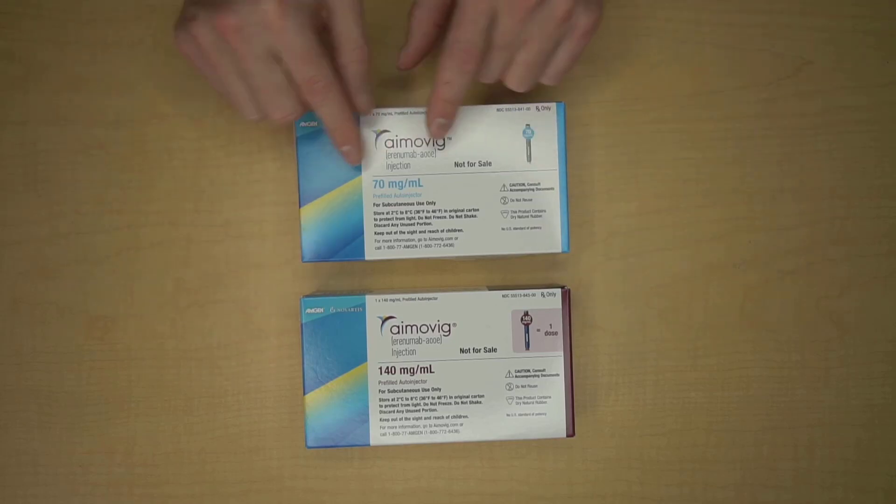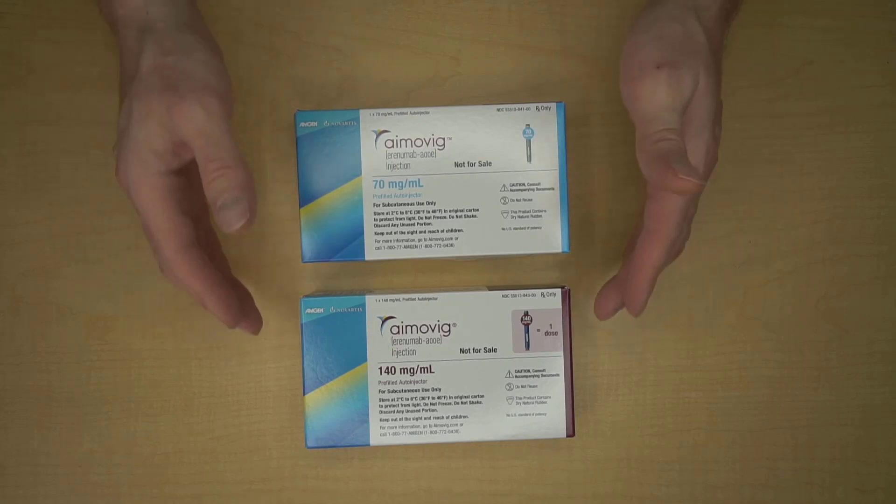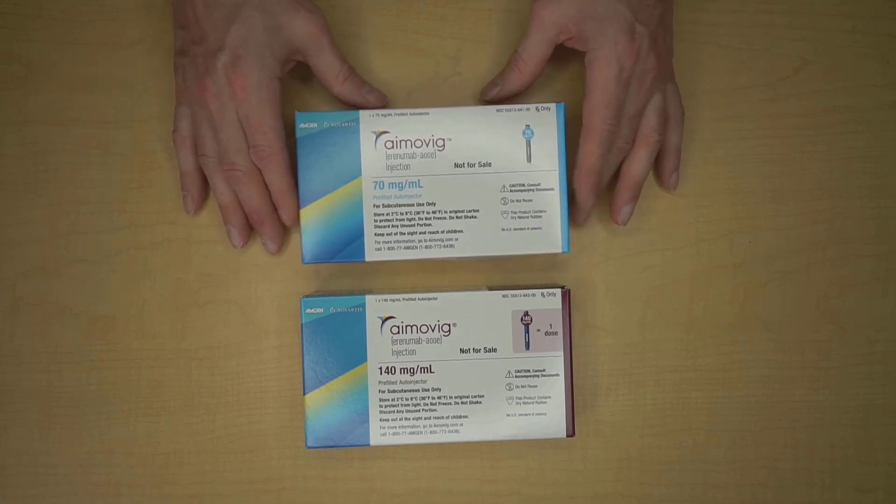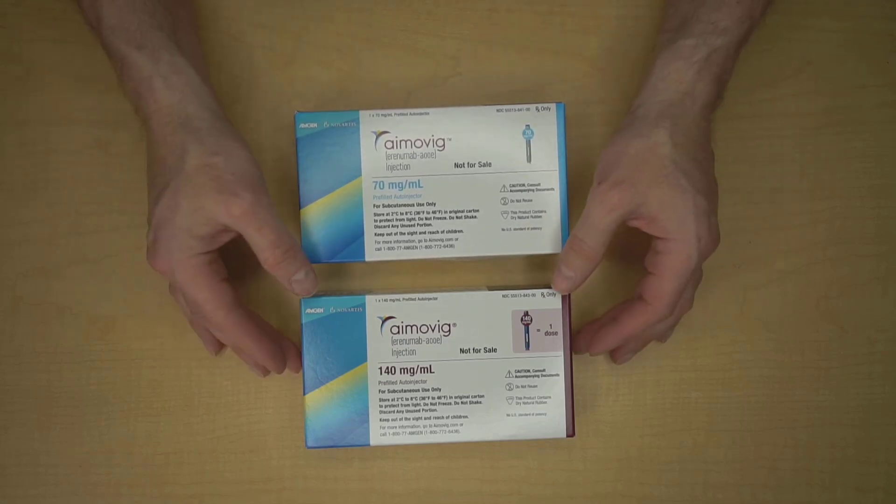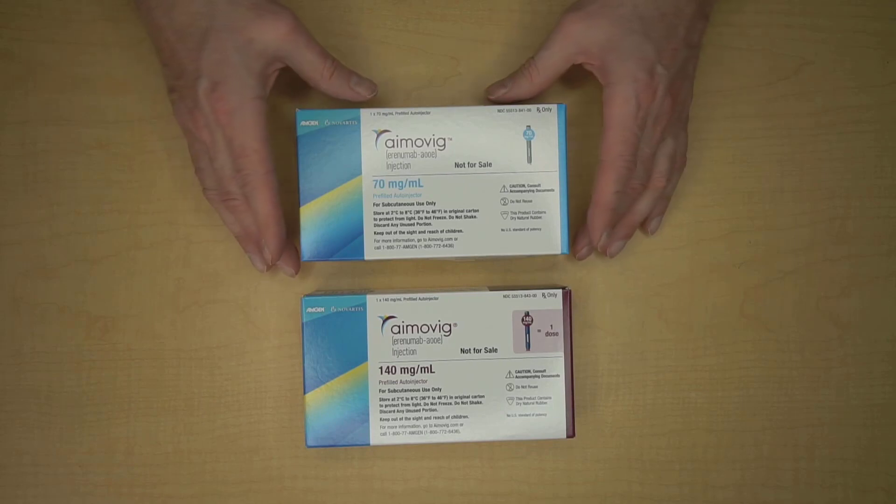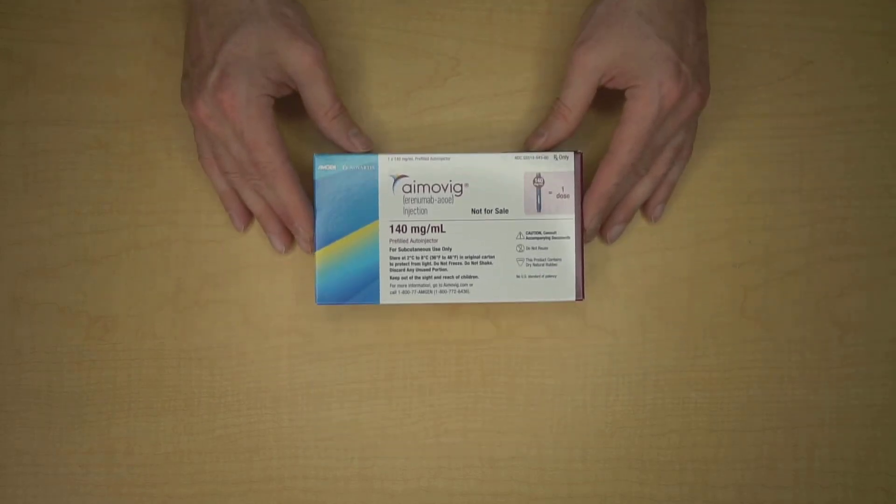When Amovig first came out, it was only available in a 70 milligram pen, but now Amovig has a 70 and a 140 milligram pen. So when Amovig first came out, people on the 140 milligram dose would be taking two 70 milligram injections. Now they can take one injection that has 140 milligrams in it. Because these are very similar, I'm just going to put one of these away, and we're going to open the 140 milligram dose.